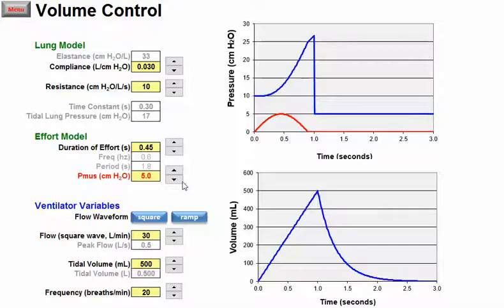So that's one reason I like the new functionality, because I can show asynchrony. I'm just going to go ahead and decrease this again, and as you notice once I decrease this it goes away and I have a normal ramp of pressure waveform.